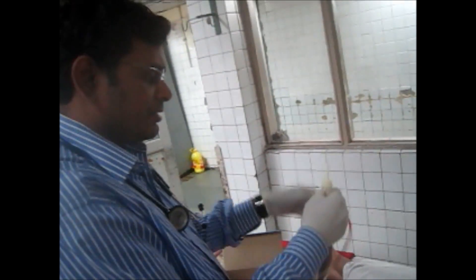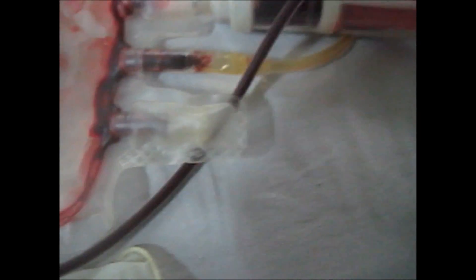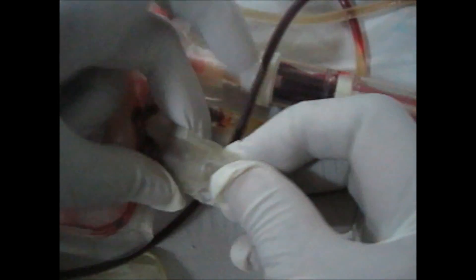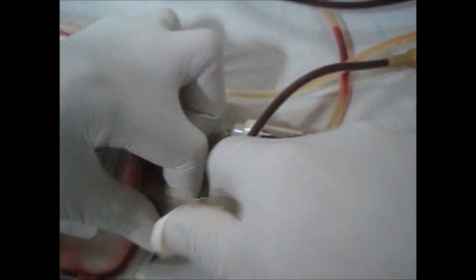Now carefully see the steps on how to attach them, because sometimes we have seen that some doctors tear the blood packet by wrongly inserting it. Now you have to open this packet. Have a close view — you have to tear this rubber, this plastic, from the middle.